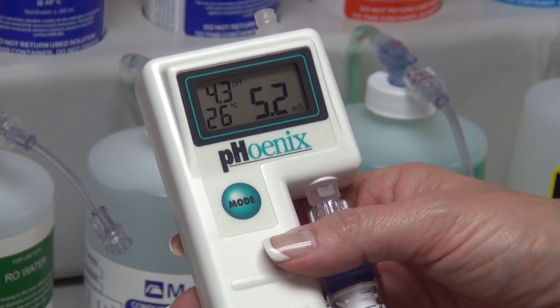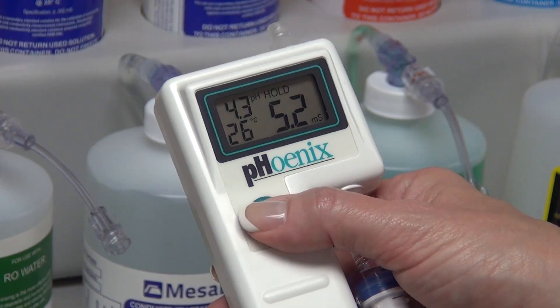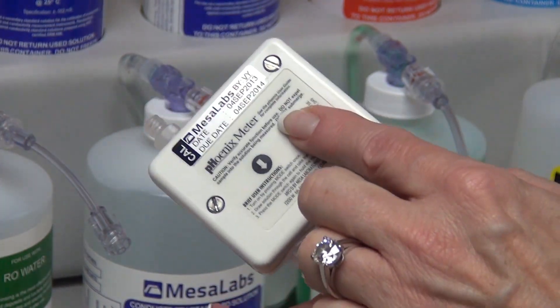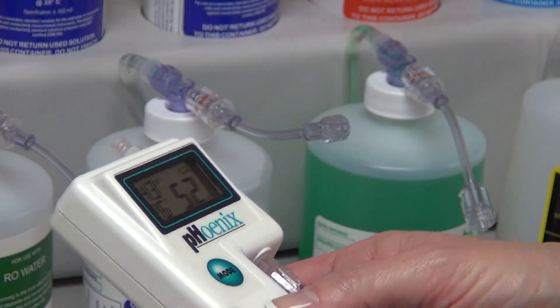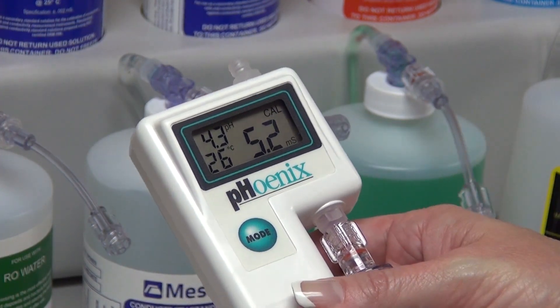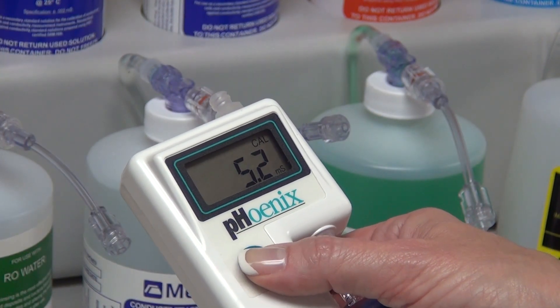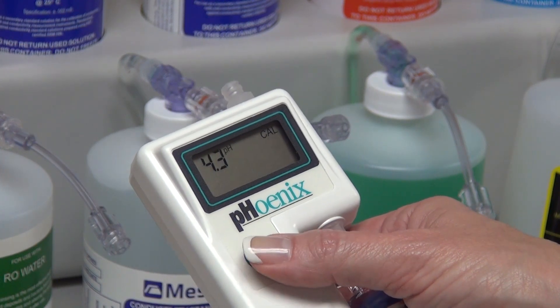To enter the Level 1 calibration mode, press and hold the mode switch until a flashing cal appears. Within 3 seconds, press either the up or down arrow switches on the back. A steady cal symbol will be displayed. Please note, a quick press of the mode switch will alternate between the functions to be measured: conductivity and pH.